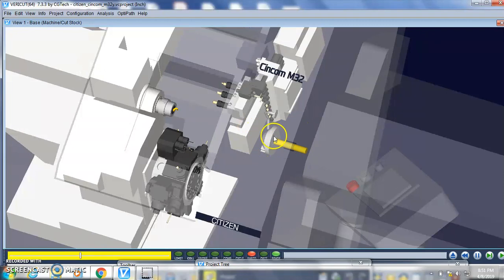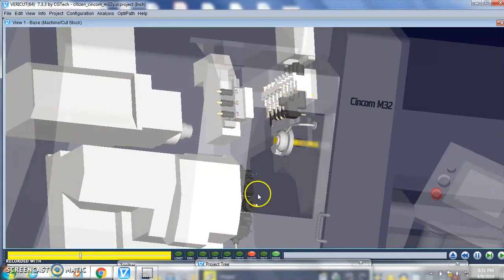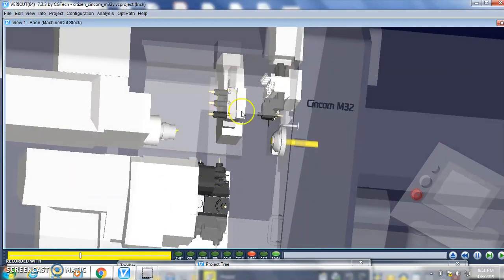So there is the guide bushing, then the main spindle. You have a gang tool, you have a lower turret, and the back end tool. Each of them is controlled by 3 different programs, so like a 3-channel program running simultaneously.